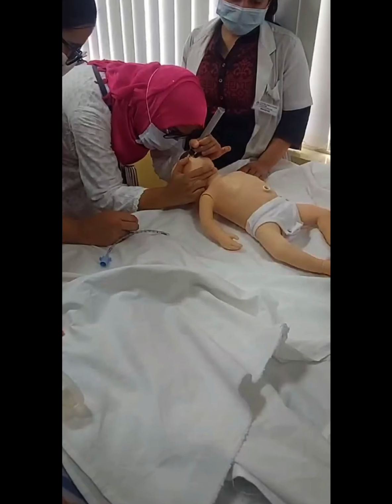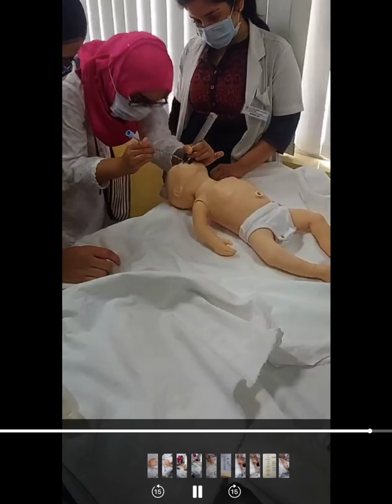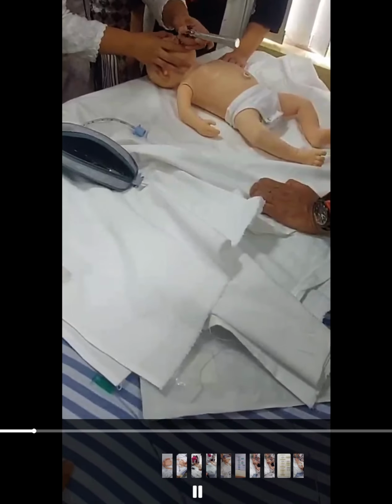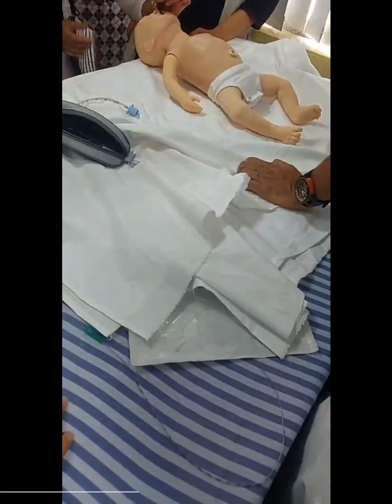Some people will require pressure. At that time you will ask someone to apply it, because you are with gloves. Then you will introduce the ET tube. Okay, guys. So basically the blade that we use here is the Miller's blade, that is a straight blade. This has been discussed in my anesthesia video, guys.